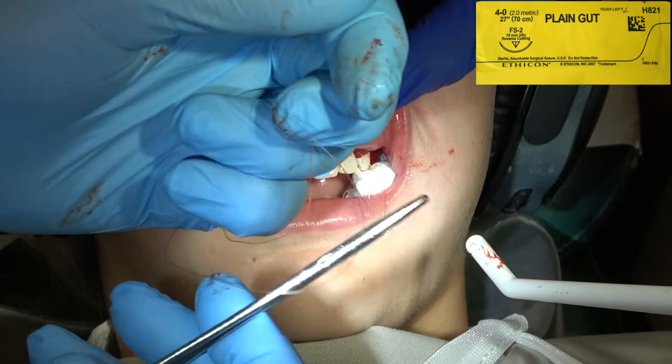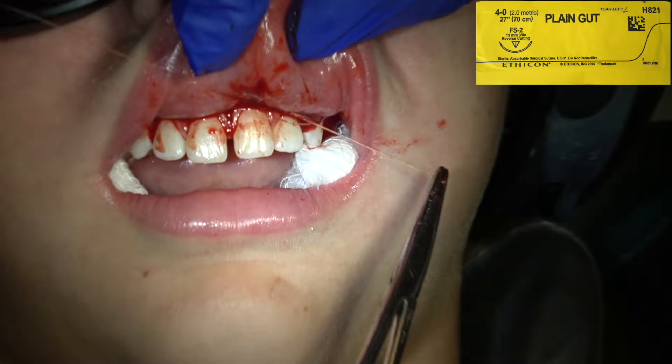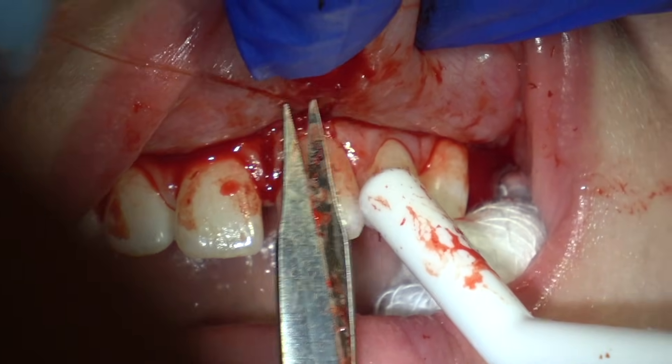Three away, one towards you, one away. Make that knot flat when you pull it. We're leaving two to three millimeters of excess when we cut.